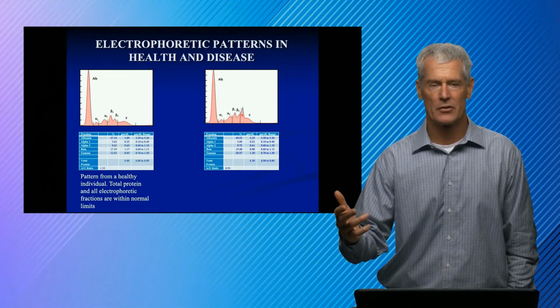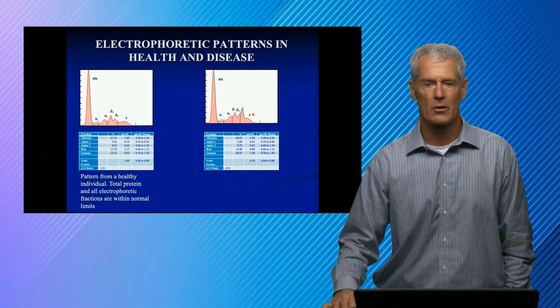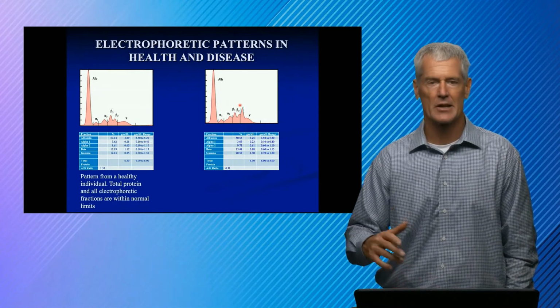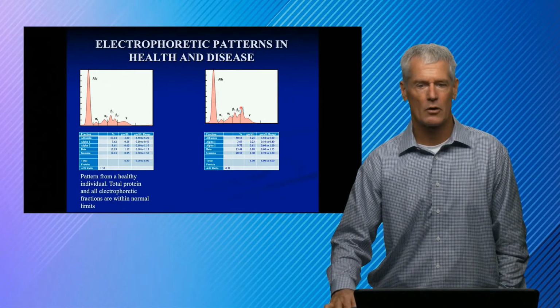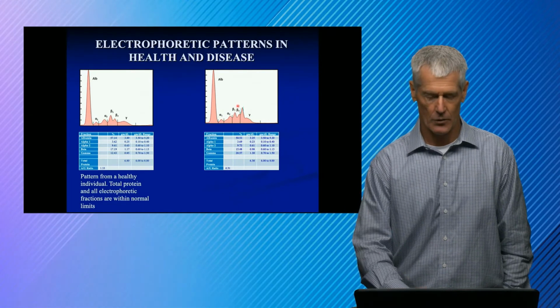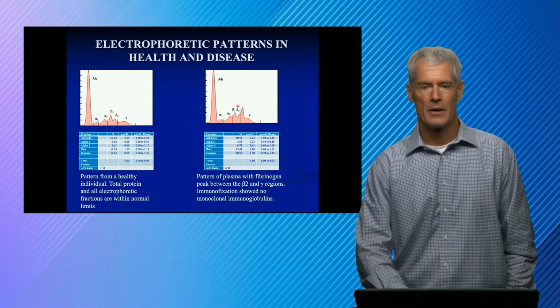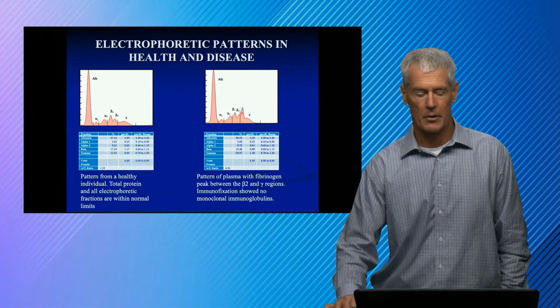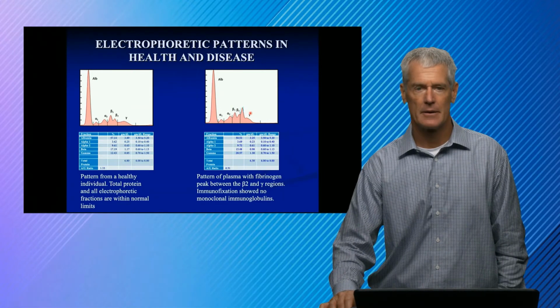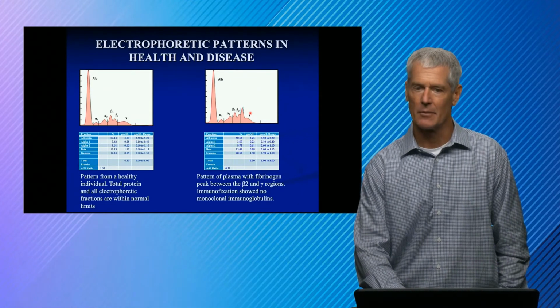The lab received it as a serum sample. We thought it was serum. We ran it, and we got this apparent monoclonal protein that was not an immunoglobulin. And so basically, we redrew that patient, correctly collected a serum sample, and this peak went away. And so that's really a pre-analytical artifact that we try to avoid. So that monoclonal looking protein, it was in fact a monoclonal protein, but it was not an immunoglobulin. It was fibrinogen. And so we avoid that by collecting the proper specimen.